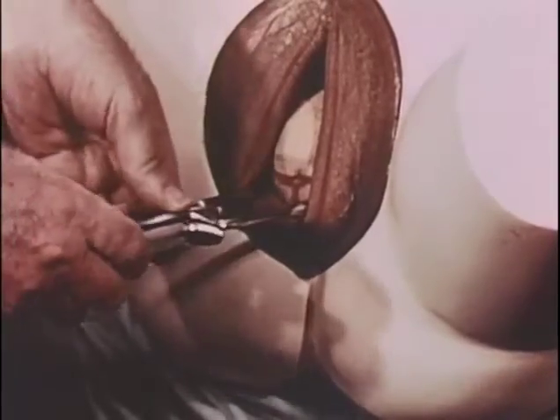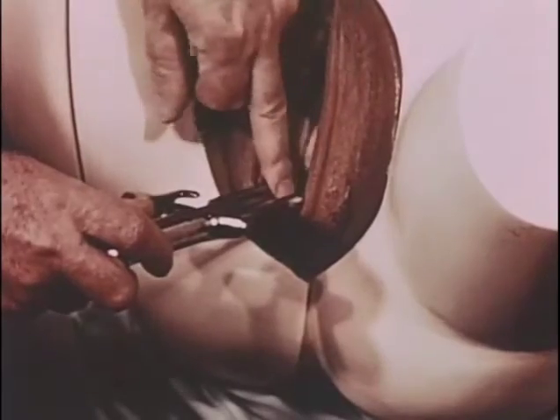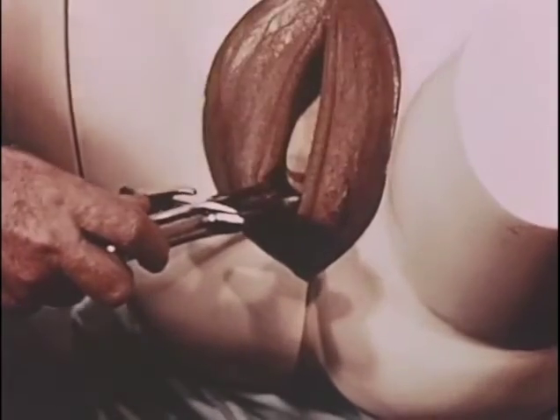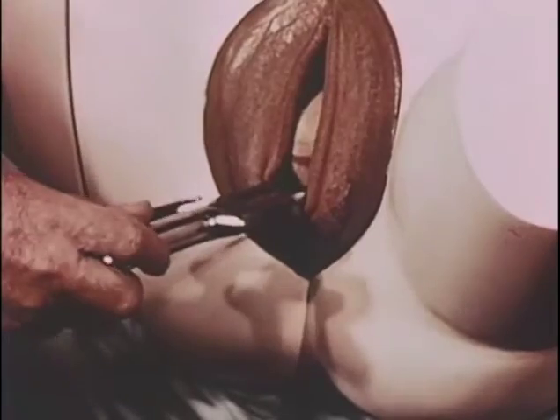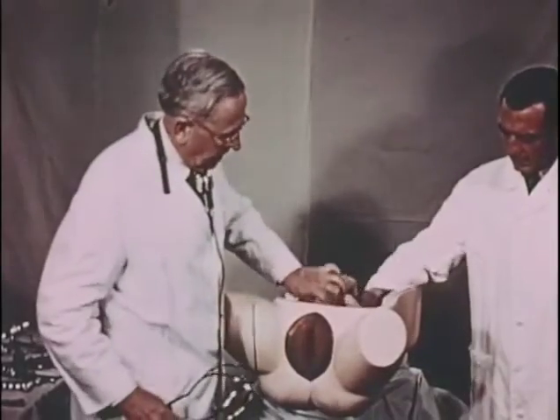If the sagittal suture appears to diverge to one side or the other after it passes below the plane of the shanks, it means that there is a faulty application. And the correction of that may be shown more readily from the outside.